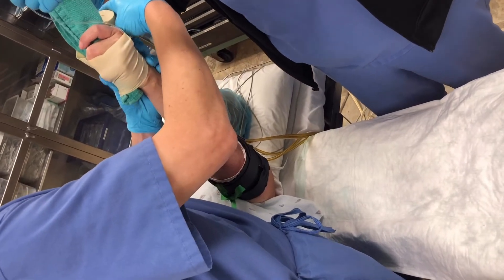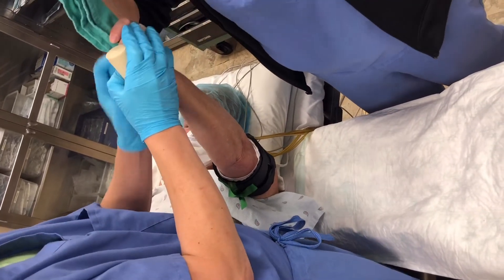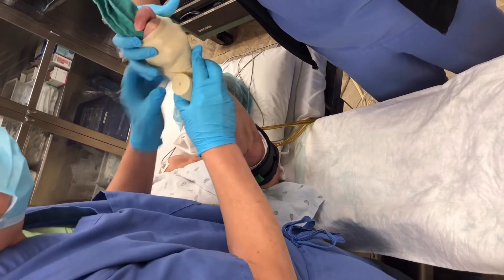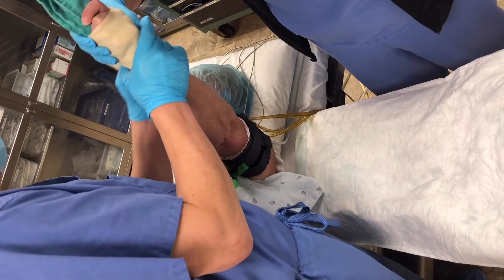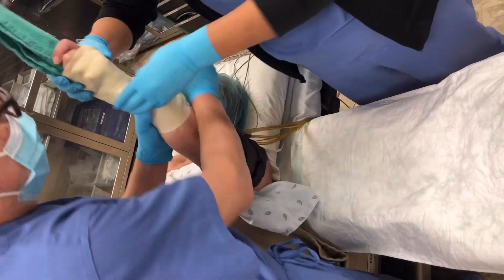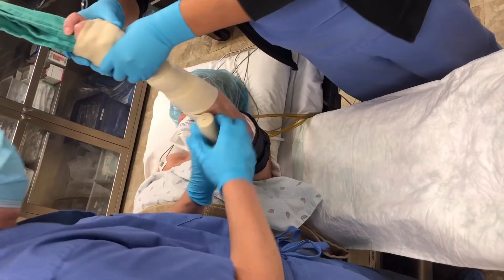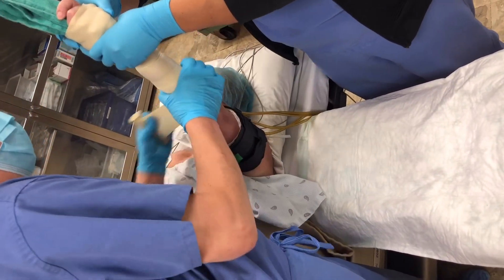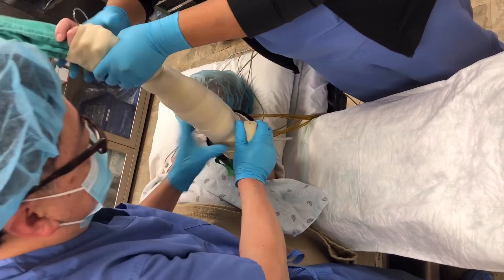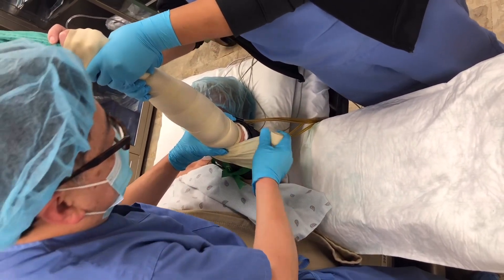Then wrap around the Esmarch bandage — start distal first, at the hand and fingers, and work down. It's pretty tight and sometimes a little uncomfortable. It's important to do a good job to exsanguinate all the blood; otherwise the block is not going to be that effective.